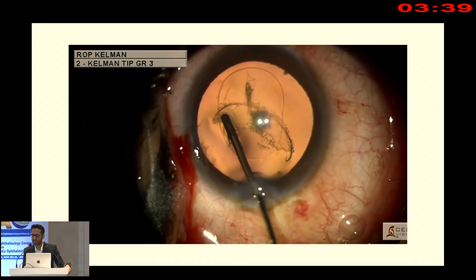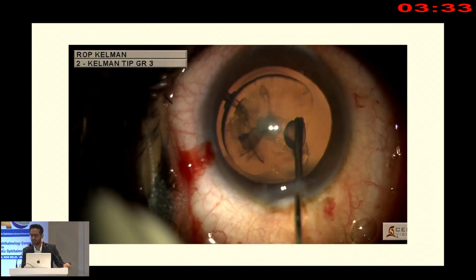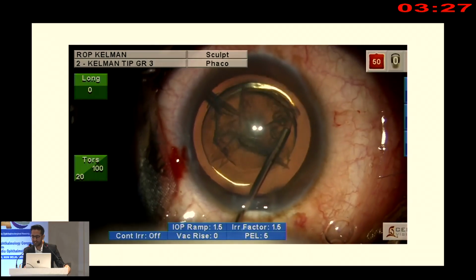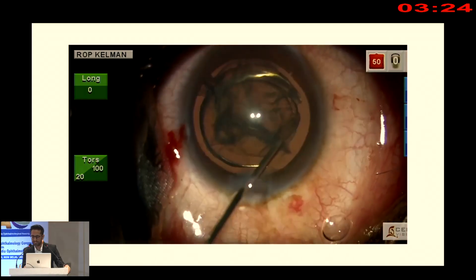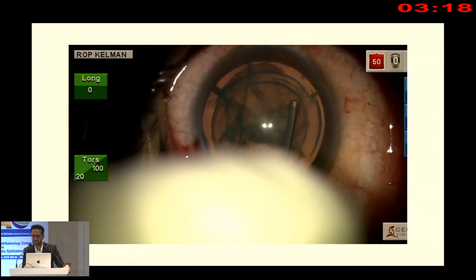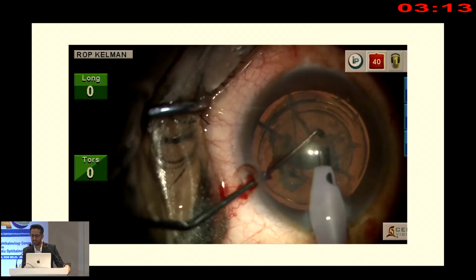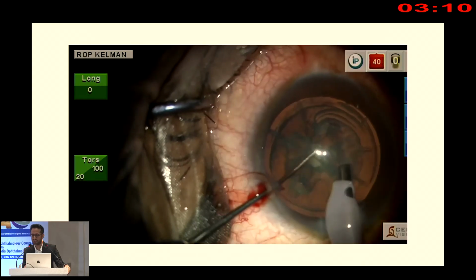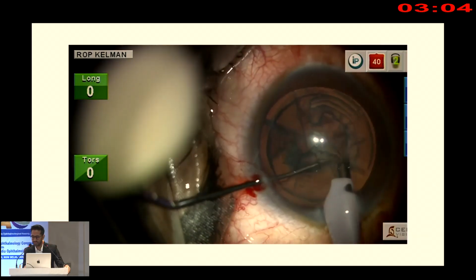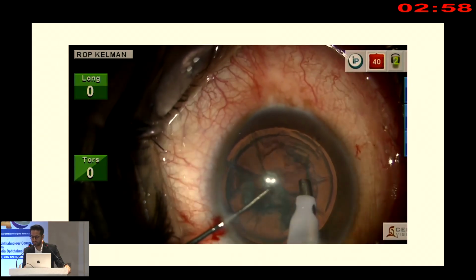And now, as ma'am had also shown initially, with these overly soft cataracts we don't do hydrodissection in any of these posterior polar cataracts with pre-existing defects. So I'm going to do layer by layer hydrodelineation, where the BSS is injected at different levels and different planes. The aim here is to have a good thick epinuclear sheet; the outer nuclear layer is used as a scaffold, as a shield to the open posterior capsular defect, and the inner nuclear layers are phacoaspirated slowly, keeping in mind not to do any rotation maneuvers.